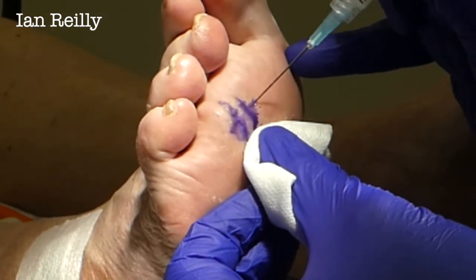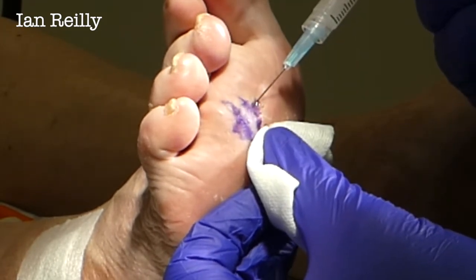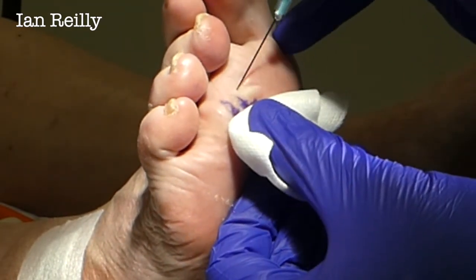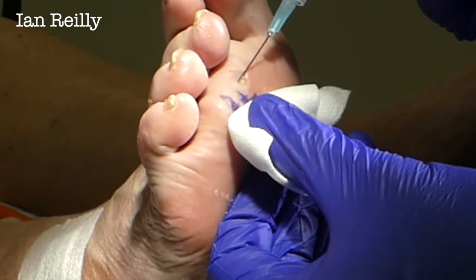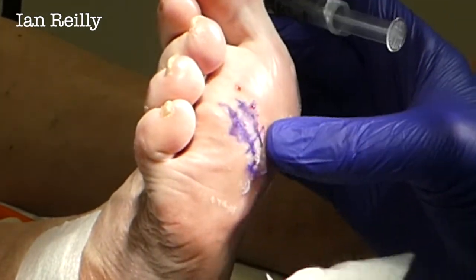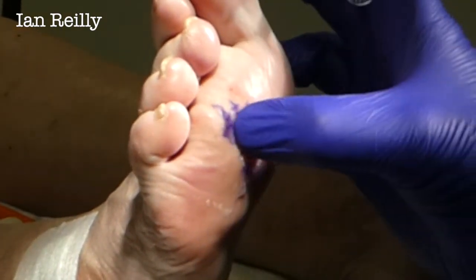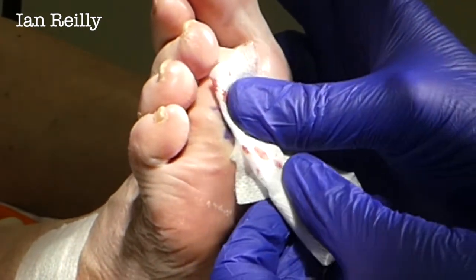How well the camera will pick this up in 3D I don't know, but I can really see that just filling. I'm putting in small amounts just to fill that area, and I'm just sub-Q — don't want to be in the joints, just a little bit sub-Q. So that's really filled that area there, you can see we've got our three little spots. Now I'm going to come back — there's also a little bit of bleed there, that's the local anaesthetic causing vasodilation, that's why we have our cotton wool at hand.